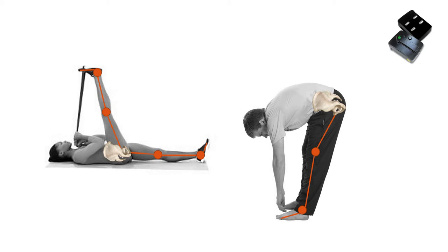Now remember that the hamstring muscle group is biarticular. It spans across the knee and the hip, and a muscle that is being stretched will pull on both of its attachments. So in the case of the woman lying down, the contralateral limb, the limb that isn't being stretched, is maintained in a neutral or starting position, whilst the other limb is being flexed, whilst the knee is extended.